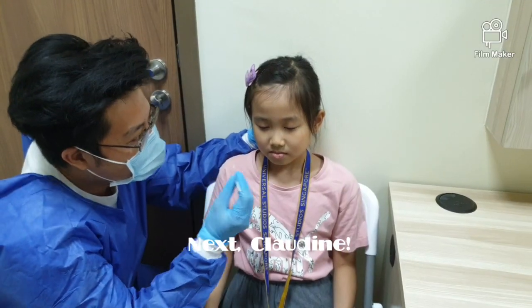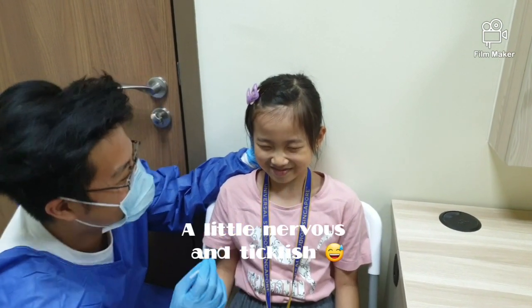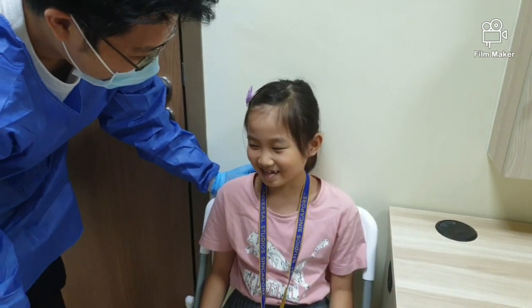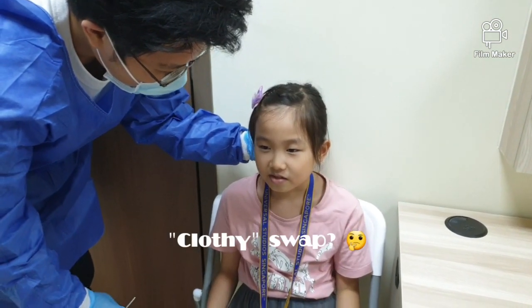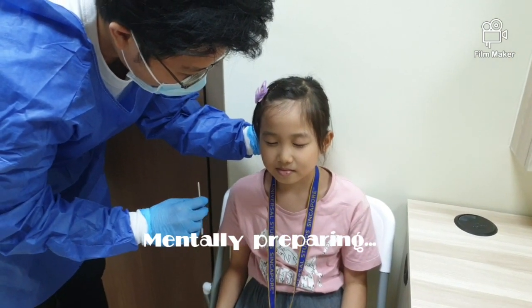Okay guys, just relax. You need to help me out. Okay. That was funny. But I make my eye water and it's very cloth-y. Okay. Very fast. I'll do it very fast, okay?